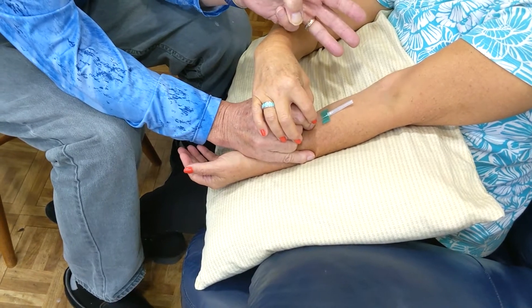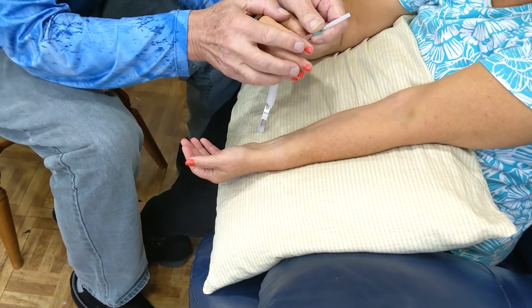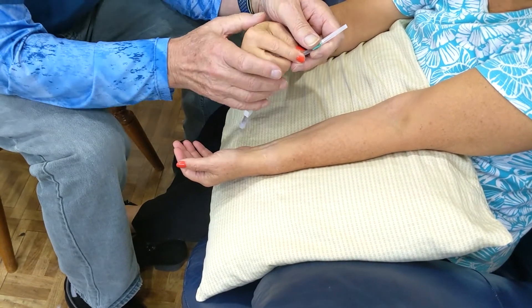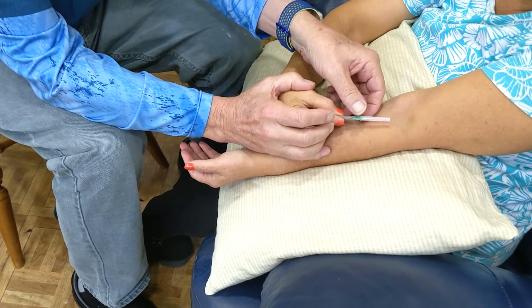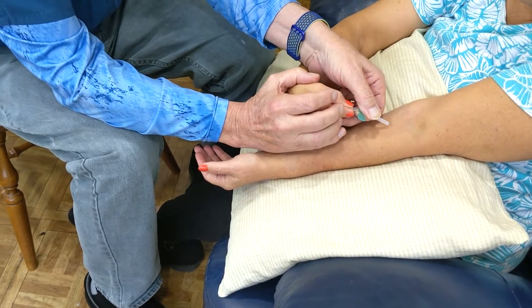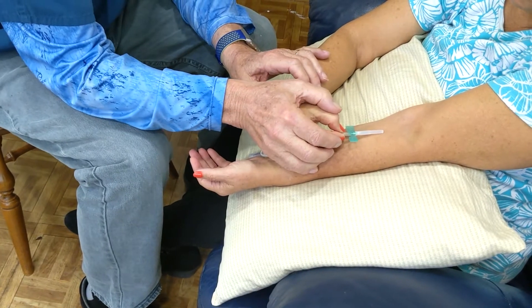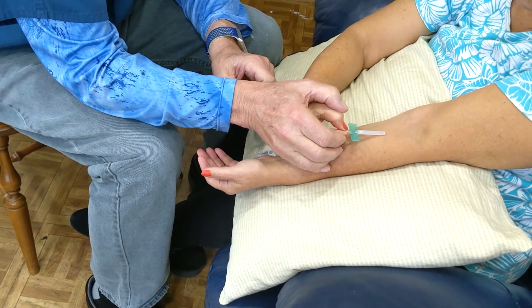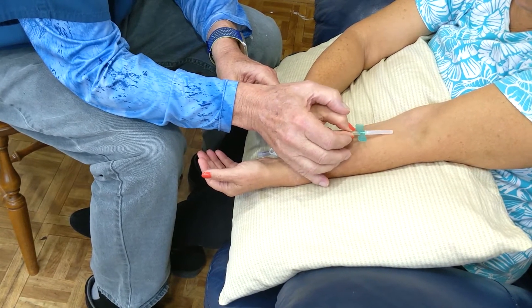You do this for three times. Then the last three times we change and the patient takes over. Put the palm of your hand down — you've got to change this angle here a little bit. Bring the needle up so you're at the angle you want to be at. Then I put my hand over the top of hers in the same place and we do the same motion. Now she actually cannulates like this, as you can see.